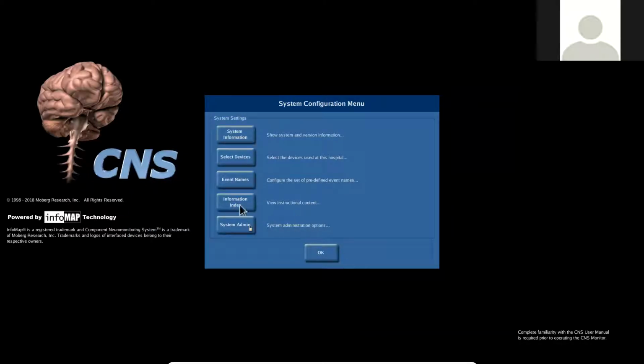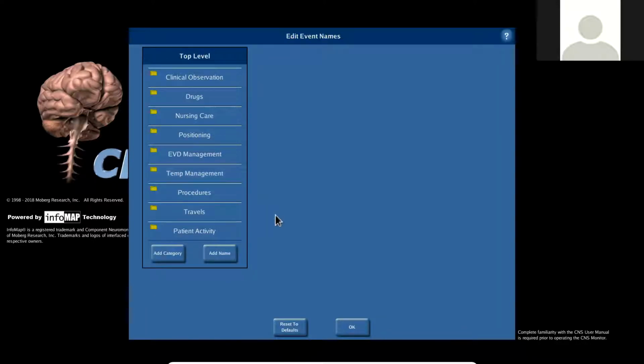That's interesting. So I guess for PICU too, because we do have some CNS monitors installed in PICU. It may depend on when you go to set up your monitor for a PICU, I'm speaking just to the customer and thinking ahead, it may be good to look at the standard ones and think of which patients you are planning to use the CNS monitor on the most frequently. Because some of these things for adults may be more applicable to your older patients or to some very specific neurosurgical patients, even if they're very small. So exactly, yeah.